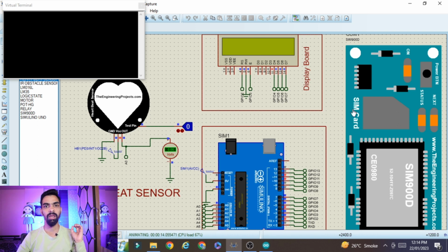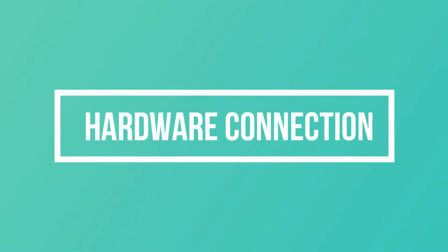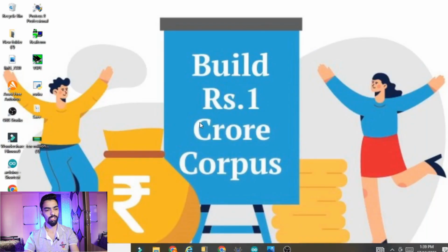Now we will see the hardware connection and then we will see the programming part. So first of all you require Proteus 8.9 software. I use Proteus 8.9 software. If it works on your other software then well and good. If it does not work then you should use the Proteus 8.9 software.